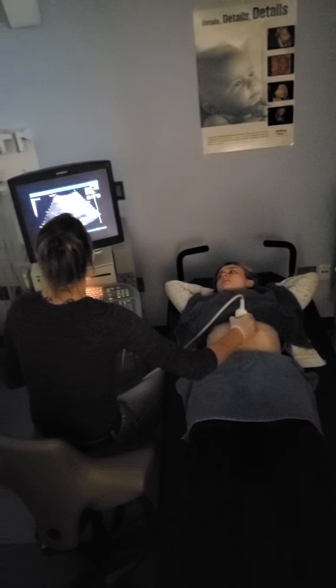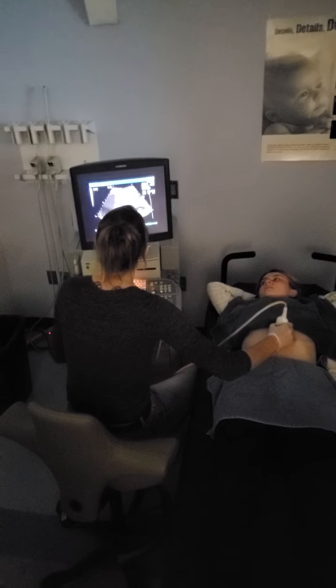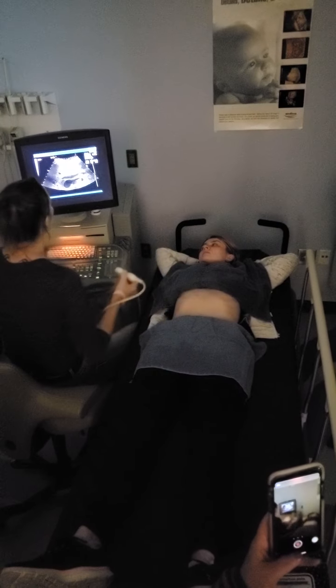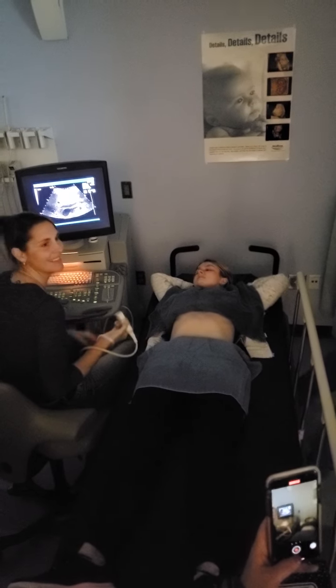So we're going to continue down here. Here he is, and I'm kind of true transverse, he likes to be about 10 o'clock to lengthen him out. How are we feeling so far? Looks easy, doesn't it? Yeah, easy when you do it.